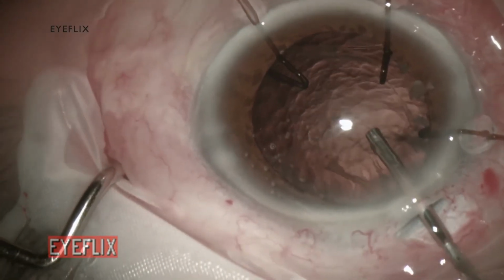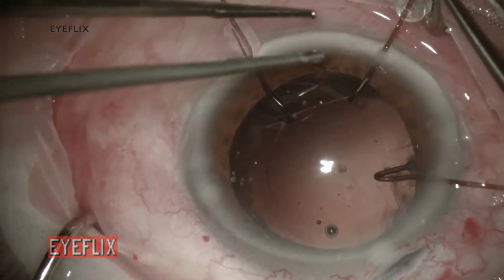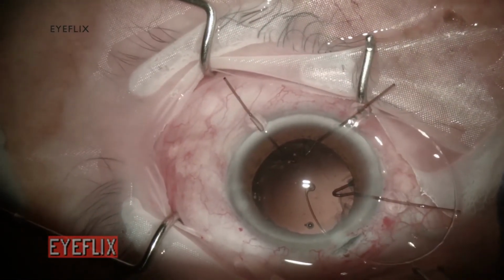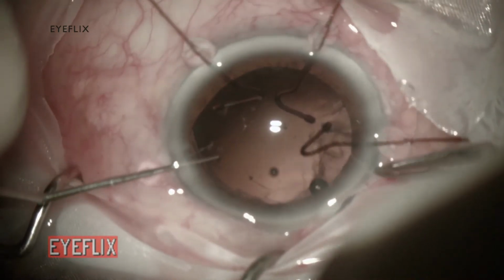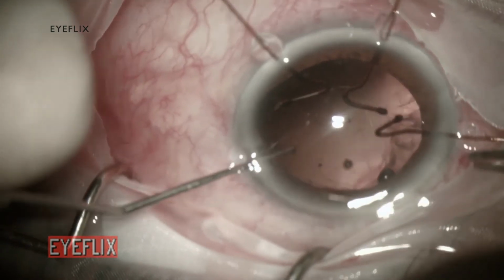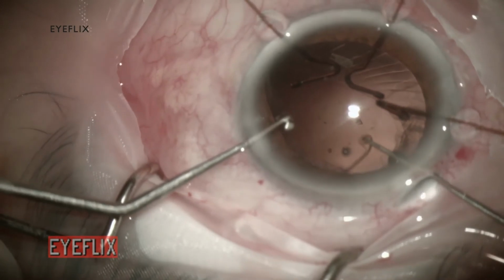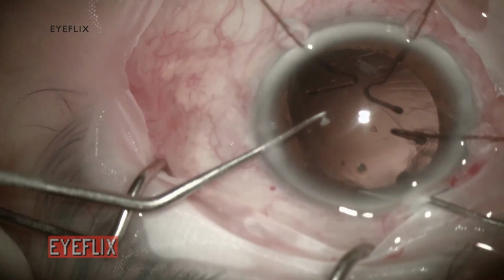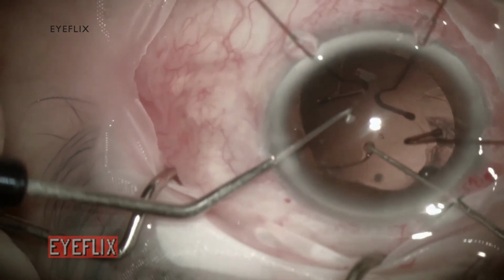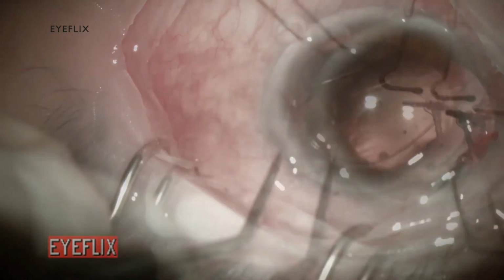I am now inserting viscoelastic and loosening the capsular retractors to insert the capsular tension ring. I had a bit of a struggle to insert the capsular tension ring manually. Actually, the first time I released it, I saw it was headed towards the angle instead of the bag, so I had to recapture it and release it again, this time aiming in the correct direction.